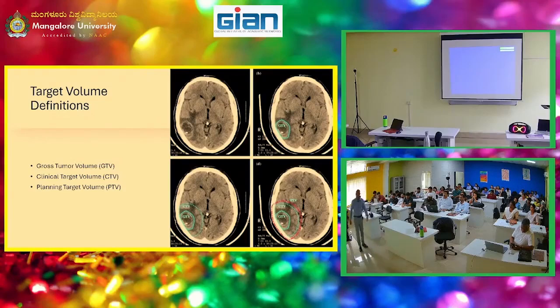Okay. But in our world now of therapy, radiation therapy, we're then going to look at what's called the clinical target volume, which is just bigger. So it's just outside. So why would I do that? I don't want to hurt healthy tissue, correct? So wouldn't it be the opposite? Wouldn't I want to make it smaller than the tumor to make sure I don't hit healthy tissue? So why am I going outside of the tumor and purposefully irradiating healthy tissue? Why am I doing that? Anybody?